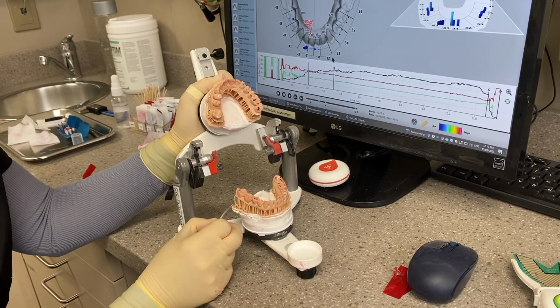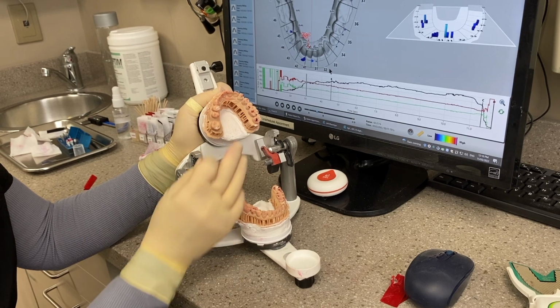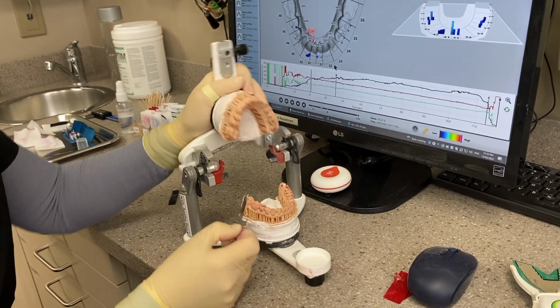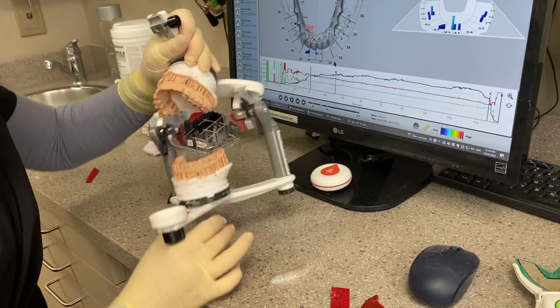The other adjustments were really minor, so I don't anticipate too much going on, but I might want to redo the 2-6 crown. So it's something that obviously I'll talk to her about. Which contact was I feeling?